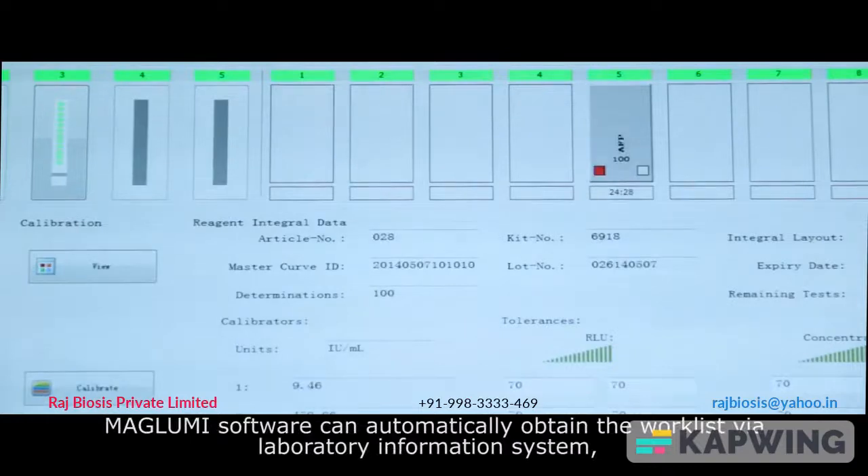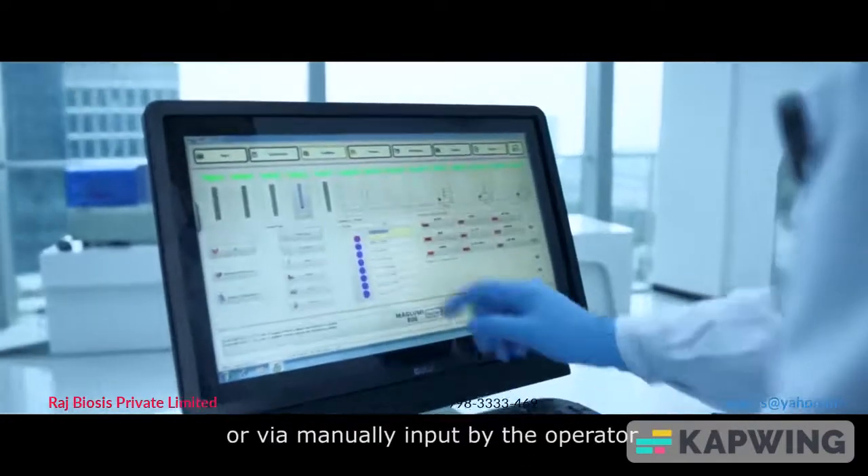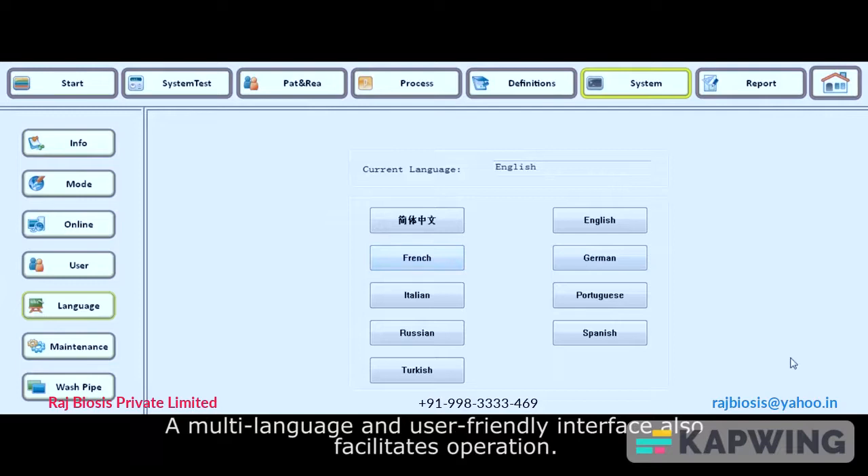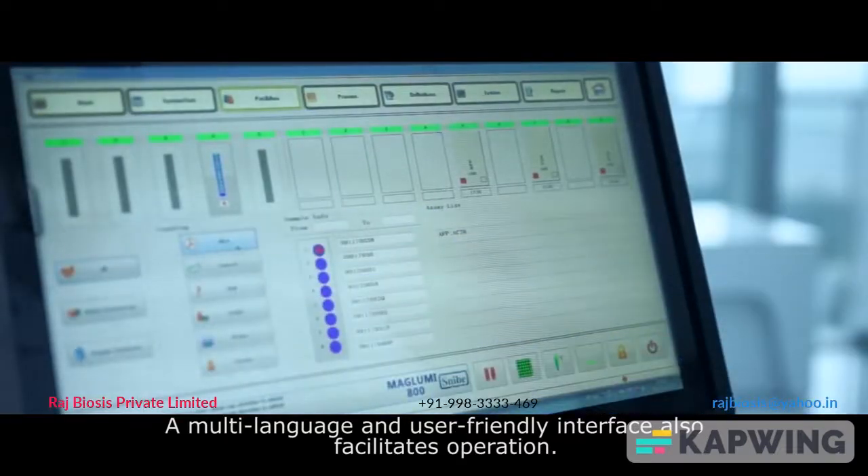The MAGLUMI software can automatically obtain the work list via a laboratory information system (LIS) or via manual input by the operator. A multi-language, user-friendly interface also facilitates operation.